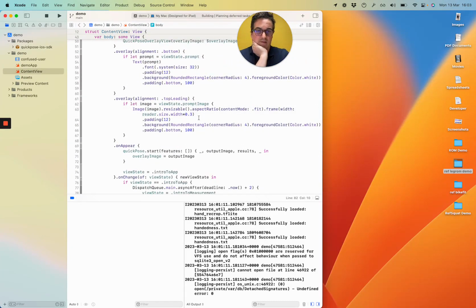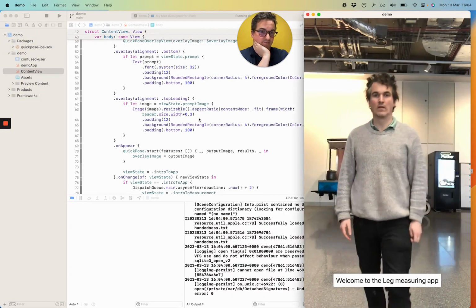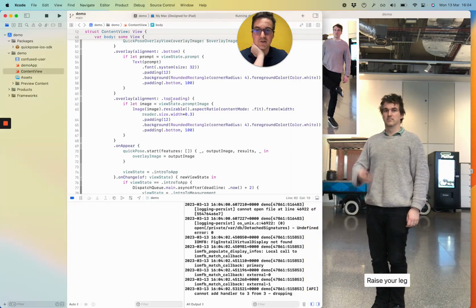Okay, let's have a look at this. Welcome to the leg measuring app. Raise your leg. Right, okay. I got the wrong side. Oh, top leading, top trailing is what I wanted.